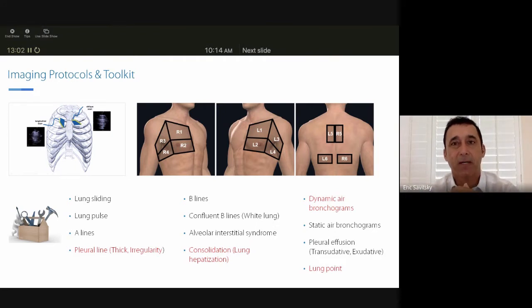And many times in point of care, you're finding time constraints, potentially uncooperative patients or patients that are in positions that make them difficult to examine. And traditionally, you're taught to scan in a longitudinal axis of the body. So you scan down, and when that's done, Milner and Son did a study in pediatric patients. Median age was about 3 years of age. And they looked at, if we just look longitudinally, how sensitive would that be for detecting consolidations? And they're about 85% sensitive for detecting consolidations when you use a parasagittal imaging plane.